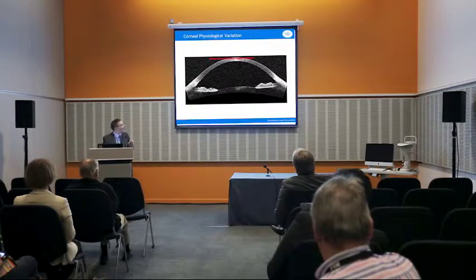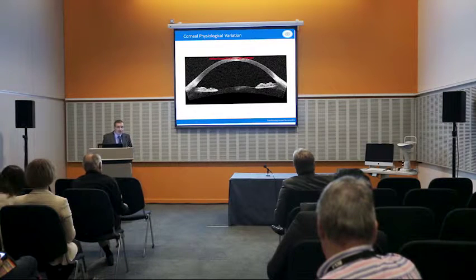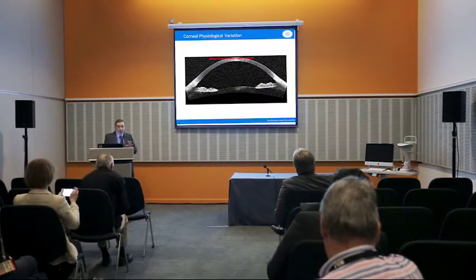So in reality, we actually get a greater corneal diameter than that which is specified by HVID. In this particular study, we found a mean corneal diameter of 13.42, and a range of between 12 and roughly 14.4. So a very substantially greater width than that which is in the traditional textbooks. But the significance of this is that you're going to get, therefore, greater sagittal height.